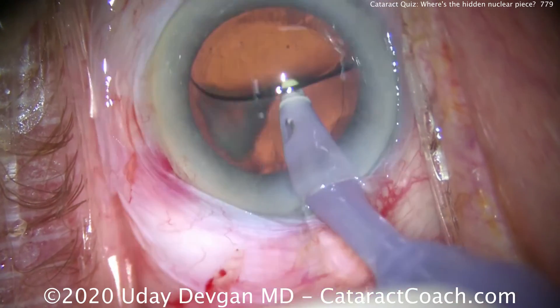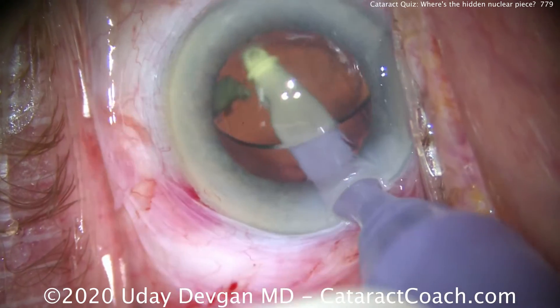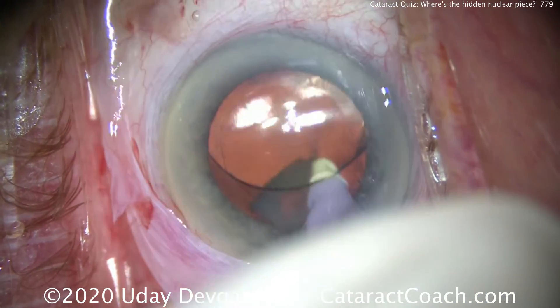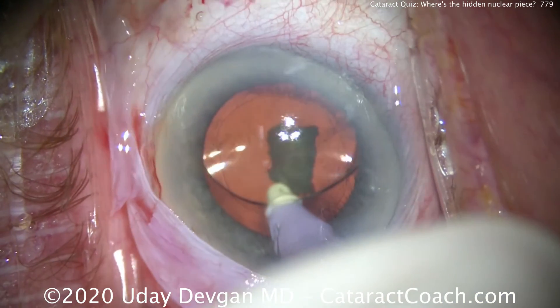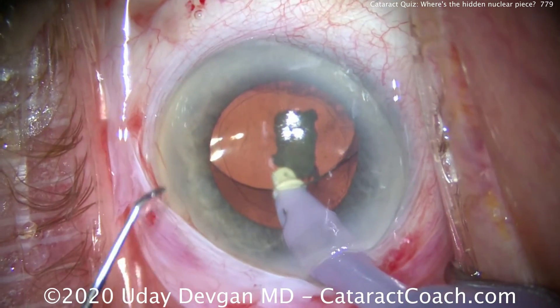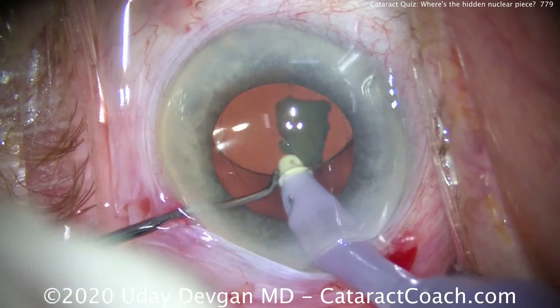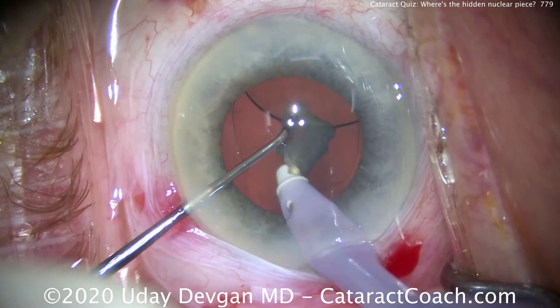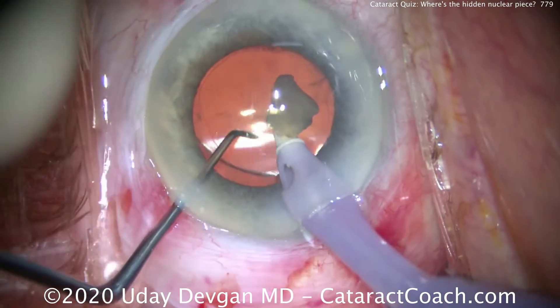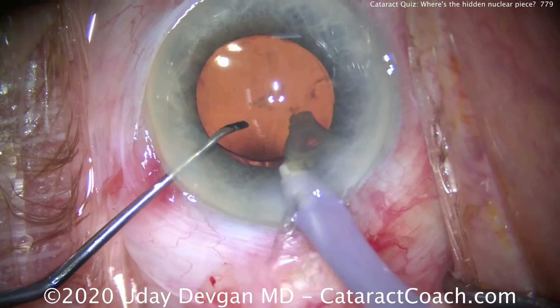Now what do I do? I can't push it through the IA probe — it doesn't want to come up. This is something I haven't seen before. So let's bring the piece up by holding it with vacuum, then use the chopper in the second hand. We'll lift up the optic and bring this piece back into the anterior chamber. There it is — it's still too dense to aspirate through the IA port.